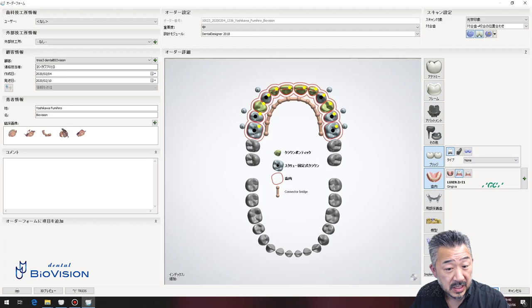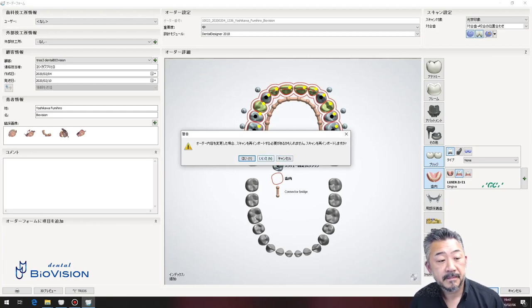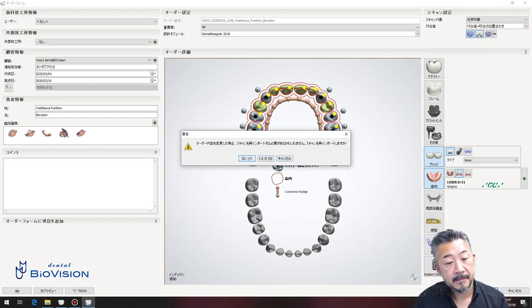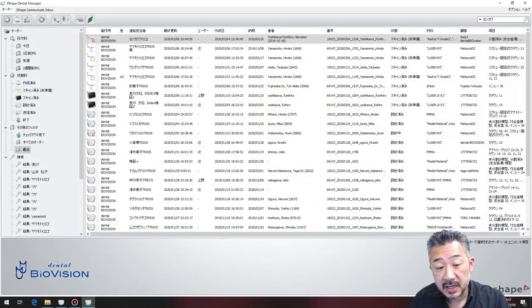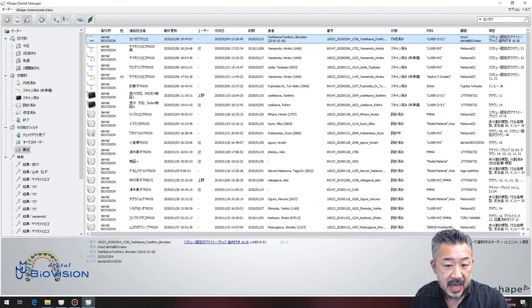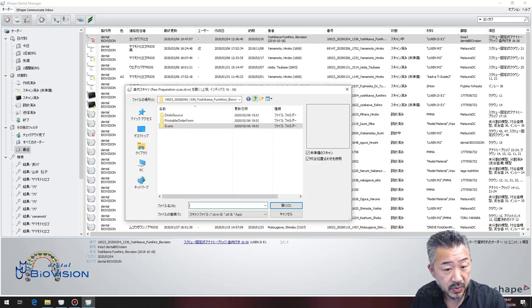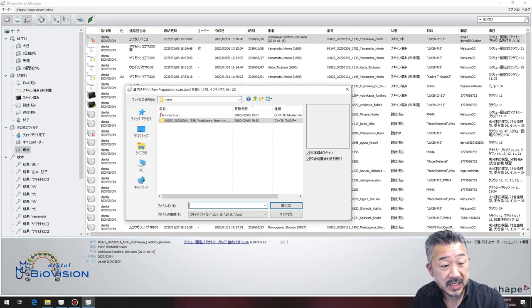It displays 'Do you want to re-import the scan?' — select Yes. Next, close the order form and select 'Import Scan.' When you select Import Scan, 'Open Gingiva Scan' is displayed.